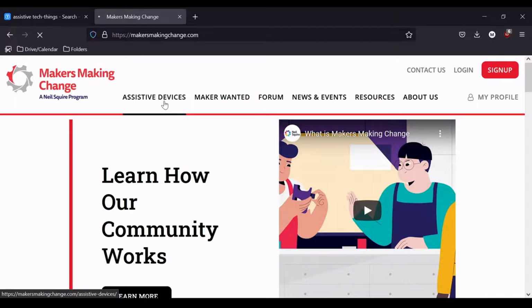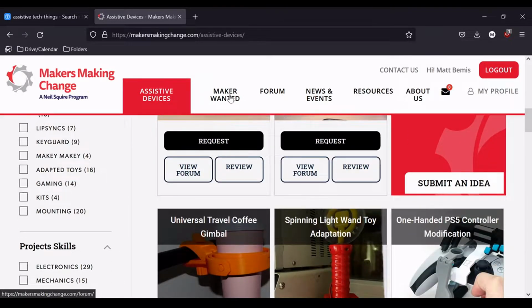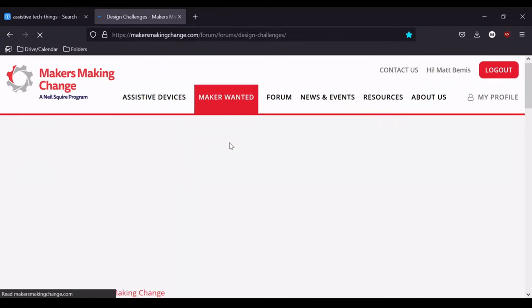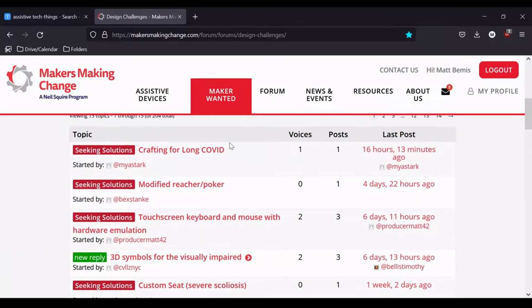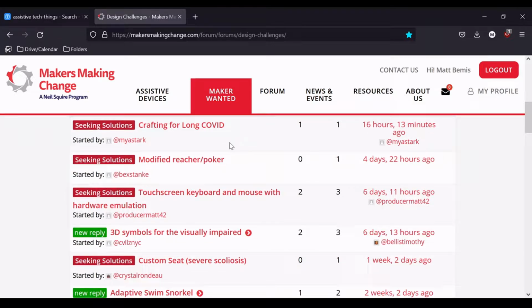In addition, this website offers things like design challenges, which I'll show you right now, by clicking over here, so you can request a device to be made or participate in designing devices for others. This might be something that becomes of interest if you start to learn the basics of 3D modeling, which I'll cover in some future videos. I think that this is an excellent way of getting practice and receiving feedback for your designs.